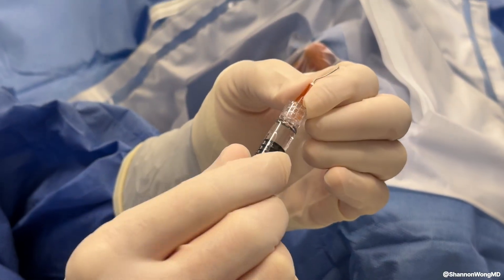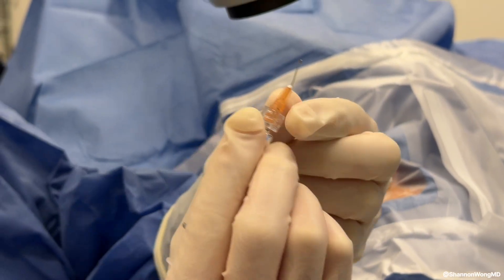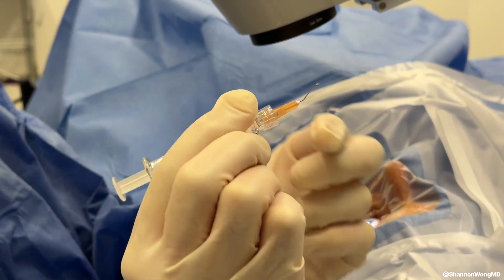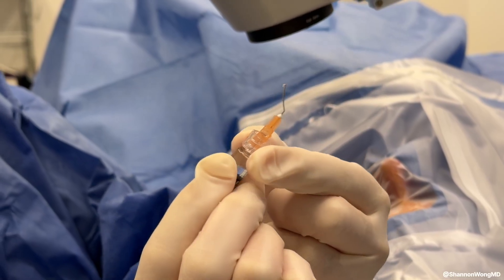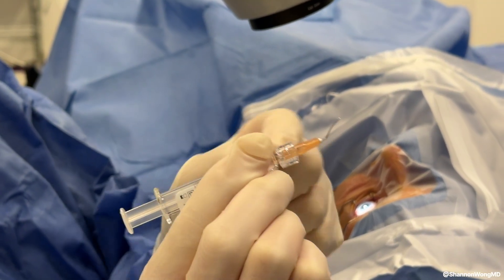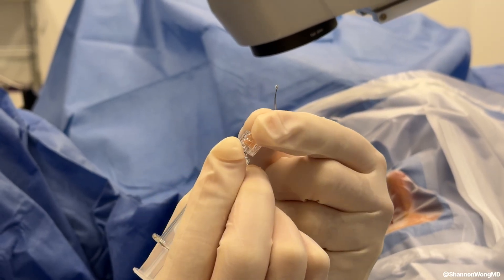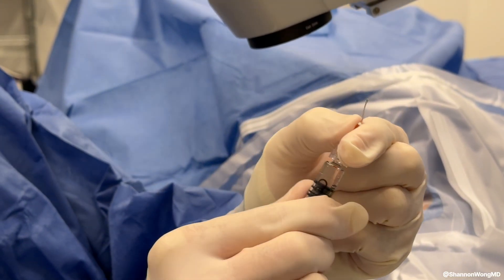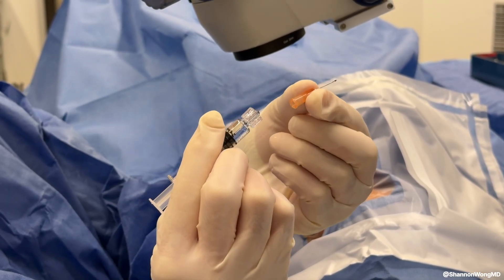When the cystotome is secured to the viscoelastic syringe, I'm unable to hold the hub of the cystotome. And when I push viscoelastic through the cystotome, it is possible for the cystotome to eject from the viscoelastic if the hub of the cystotome is not secured tightly to the syringe, which is what happened with our patient.